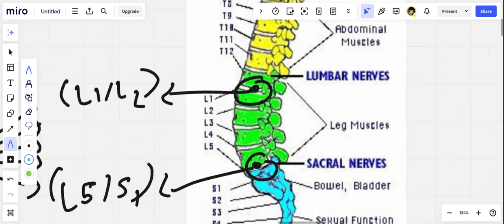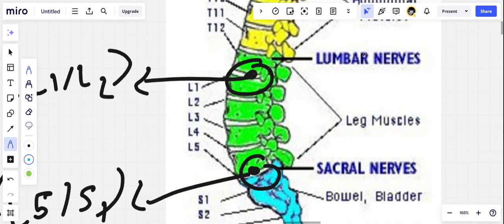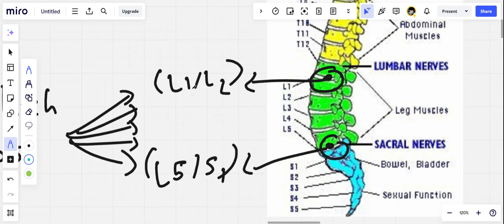We have to say exactly which part of the lumbar region the problem is. The lumbar region consists of five bone segments: L1, L2, L3, L4, and L5. The green color are the bone segments, and the white color are the spaces where the problems could occur. The problems don't actually occur at the bones, but in the spaces between two bones. So the problem could be between L1 and L2, or L2 and L3, or L3 and L4, or L4 and L5. For each of these, we should give the probability: high, low, or medium.